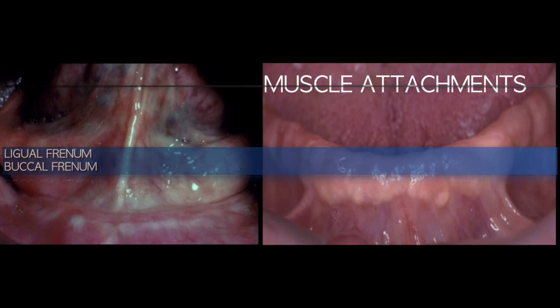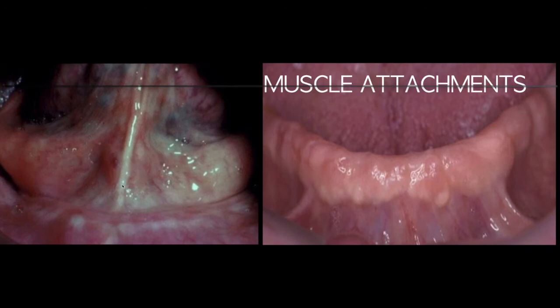And next to these planes, there is a muscle attachment called the buccal frenum. It's in between the B and I plane. And of course, in this picture, the lingual frenum is also shown. So the B plane and I plane, as discussed, will determine the contour of the removable prosthesis.